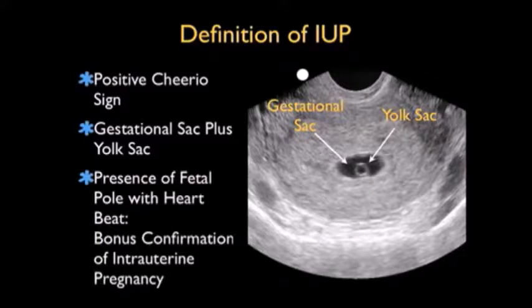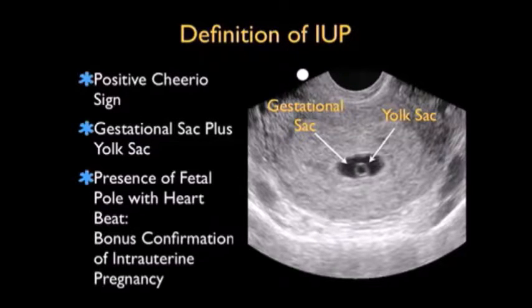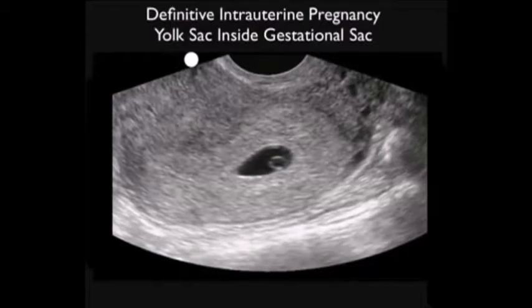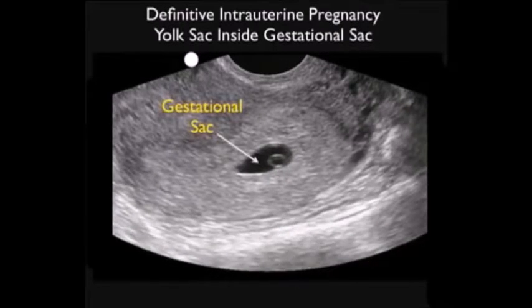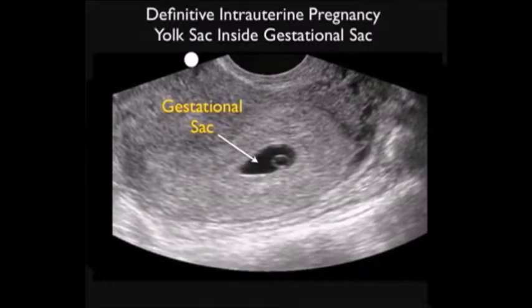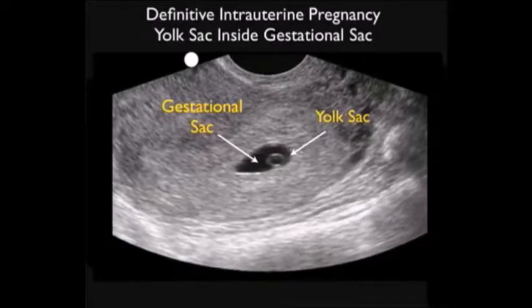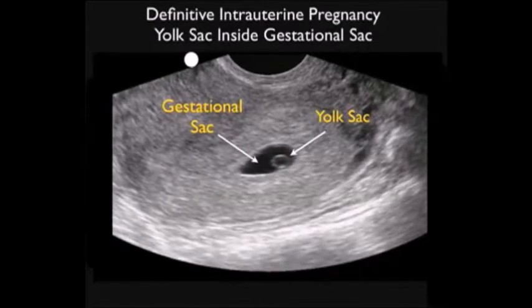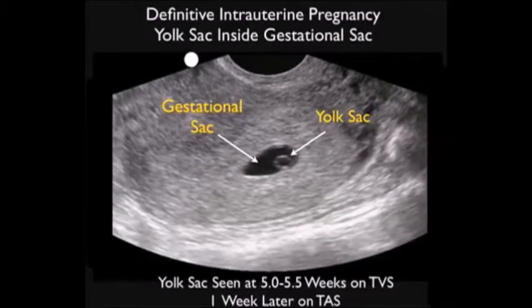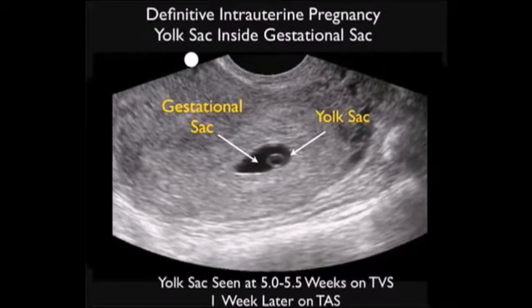The finding we define as indicative of an intrauterine pregnancy is the presence of a gestational sac with a yolk sac inside. As seen in the picture to the right, the yolk sac has a circular appearance — we call this the positive cheerio sign. Gestational sac plus yolk sac is indicative of intrauterine pregnancy. Bonus points are given if you also see a fetal pole with a heartbeat. The video clip shows a definitive intrauterine pregnancy: a larger gestational sac with the positive yolk sac or cheerio sign visible, effectively ruling out ectopic pregnancy in the vast majority of patients. The yolk sac is seen at about 5 to 5.5 weeks on transvaginal sonography and about a week later on transabdominal sonography.